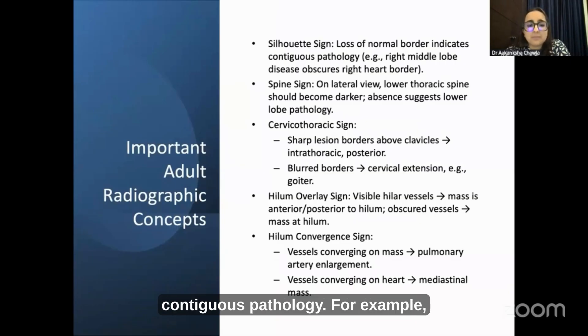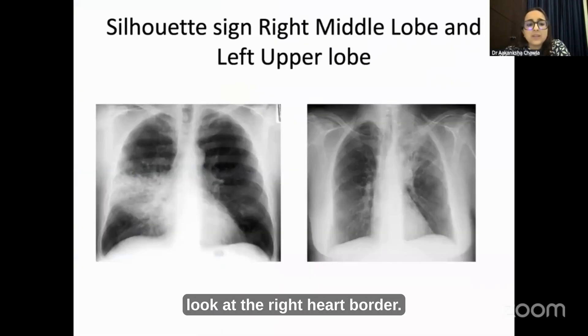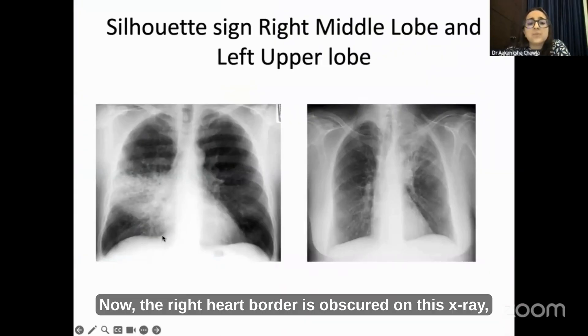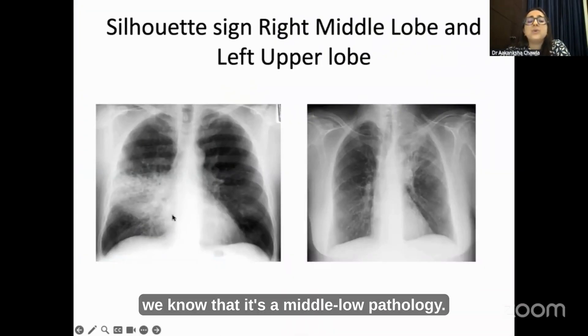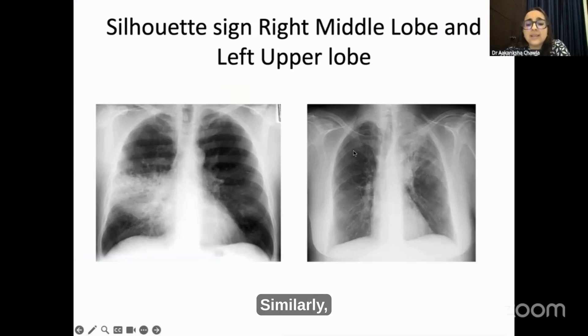For example, look at the right heart border. The right heart border is obscured on this X-ray, and when we see this, we know that it is a middle lobe pathology.